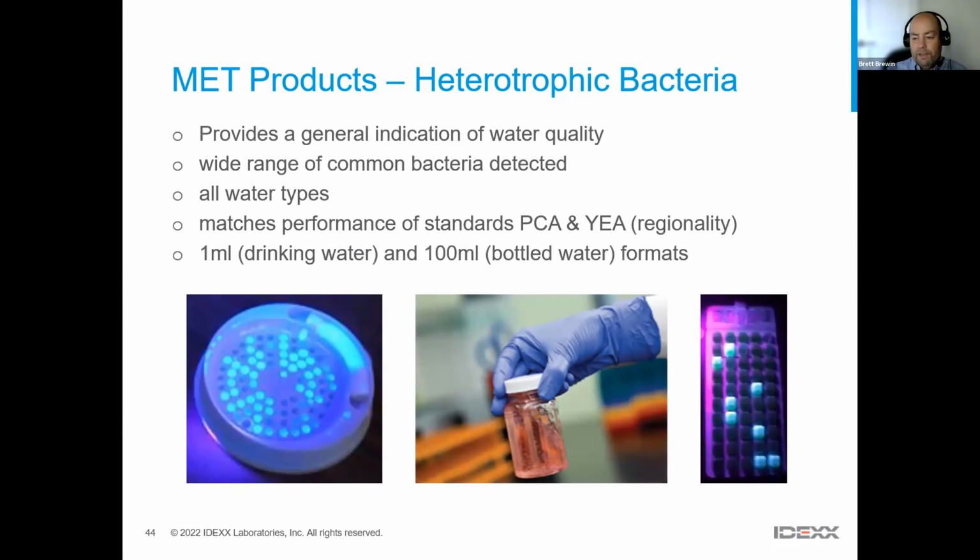Heterotrophic bacteria are basically generic bacteria. We don't speciate these types of bacteria. They provide a general indication of water quality. They're present in all water types, and there are a number of international standards that you can follow. Plate count agar, yeast extract agar, for example.